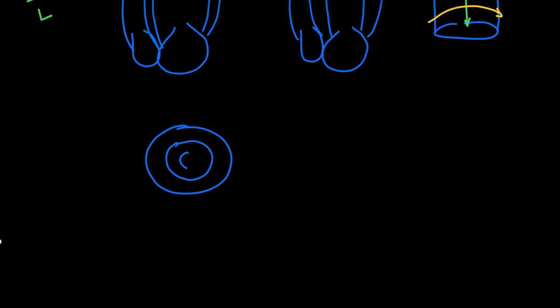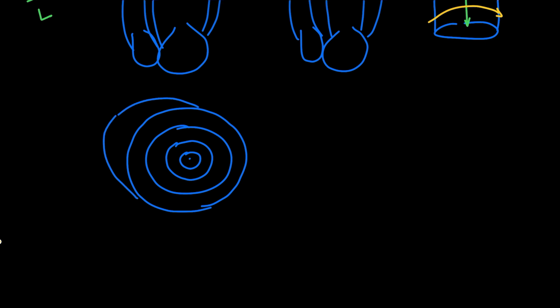I'll quickly draw those for us again here. In fact, let me make this a little bit bigger. I'm going to add a segment on the outside. So this is all your left ventricle that I'm segmenting, and then you've got your right ventricle off to the side. And there's 16 and 17 segment models. I'm doing the 17 segment model here.